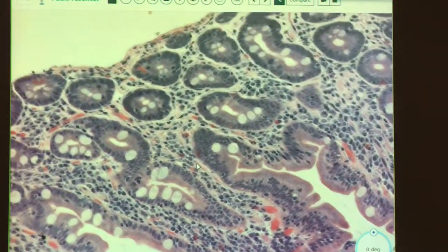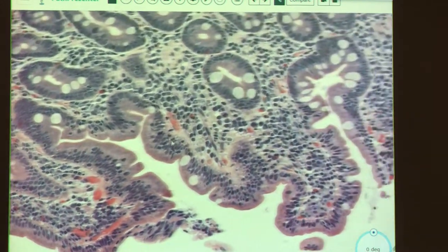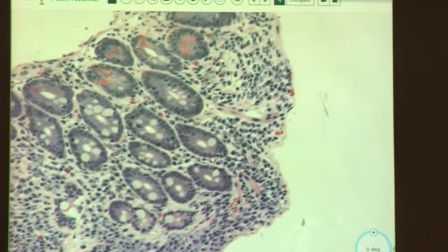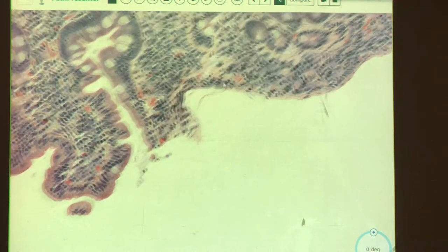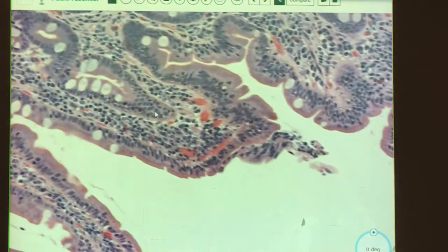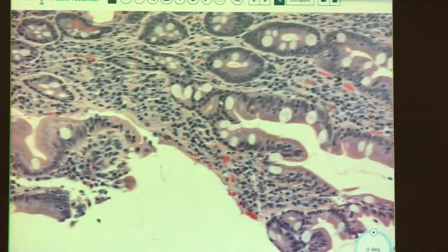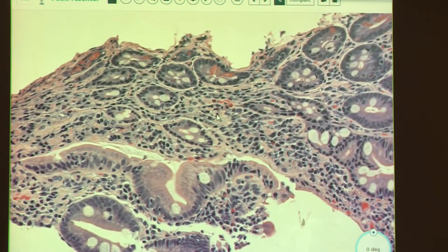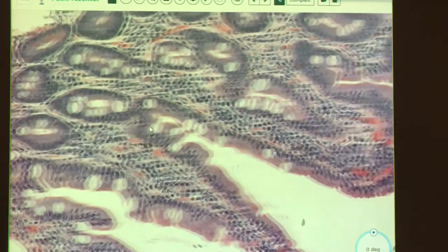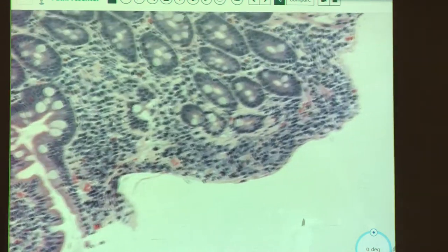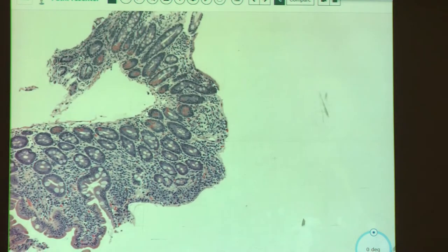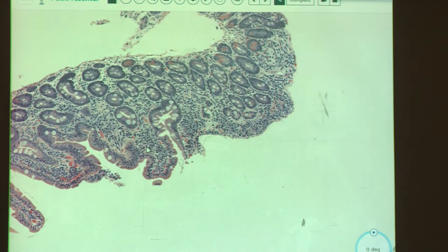Could this still be celiac? It could be — the history would help. Let's say this patient was seen six months ago with complaints consistent with celiac. They biopsied it, it looked like this. They put the patient on a gluten-free diet for six months, and this is what the six-month-out biopsy looks like. It didn't work, so it's not celiac. Could be tropical sprue, or other medications on the differential we've previously seen with celiac disease. What if this is refractory? We just went over celiac, so I'm not going to give you another celiac case.